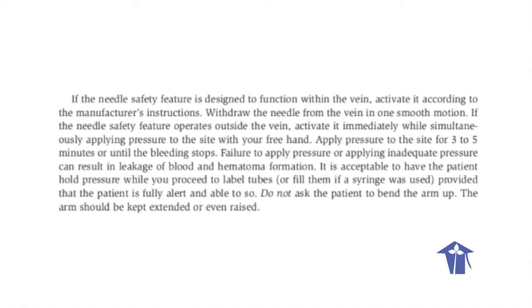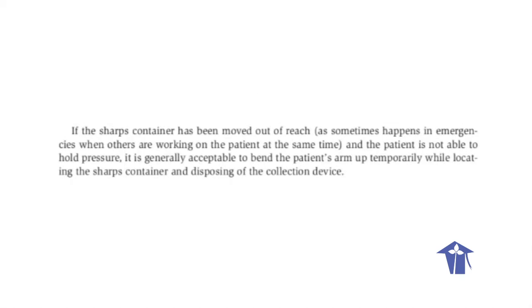It is acceptable to have the patient hold pressure while you proceed to label tubes, or fill them if a syringe was used, provided that the patient is fully alert and able to do so. Do not ask the patient to bend the arm up. The arm should be kept extended or even raised. If the sharps container has been moved out of reach, as sometimes happens in emergencies when others are working on the patient at the same time, and the patient is not able to hold pressure, it is generally accepted to bend the patient's arm up temporarily while locating the sharps container and disposing of the collection device.